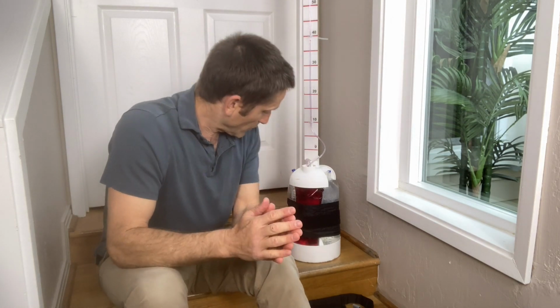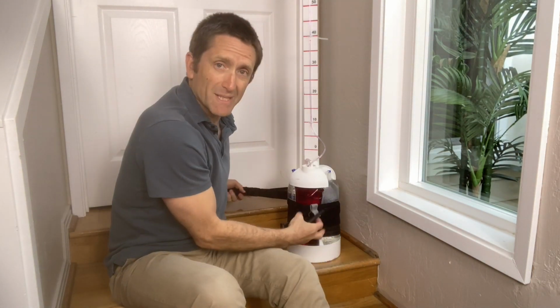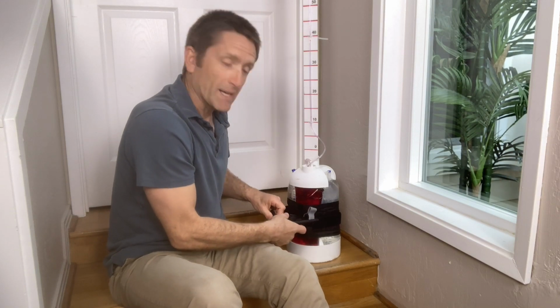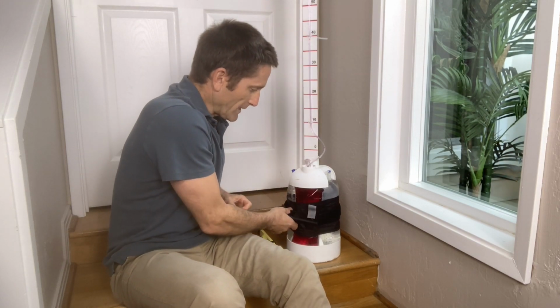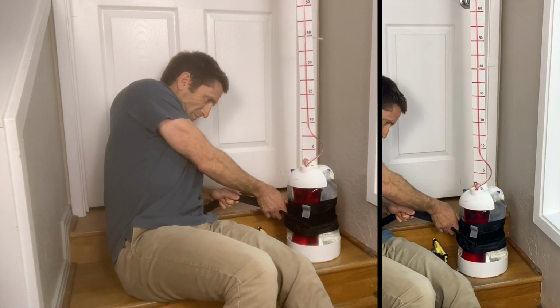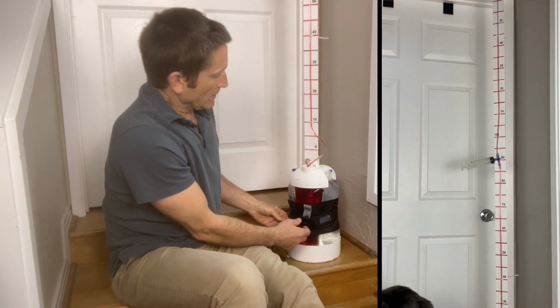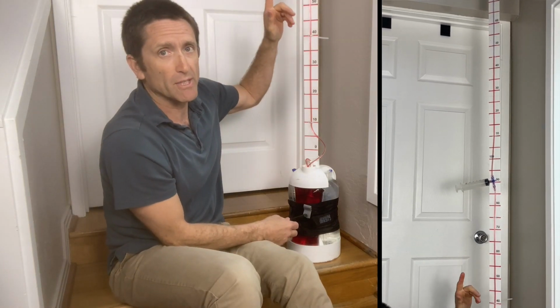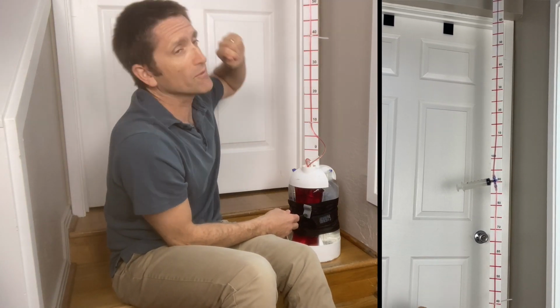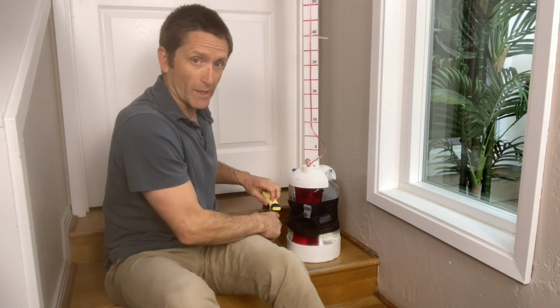But what I want to dig into more right now is torque, as well as the pressures generated when you apply the CAT tourniquet. So I'm going to use my mega manometer here. Everybody will tell you that the first cinch is the most important, and I agree. So let's see how high I can get the pressure with that first cinch. All right, so my first cinch, I have a pressure here of 145 centimeters. That's not millimeters of mercury, it's 145 centimeters of water.